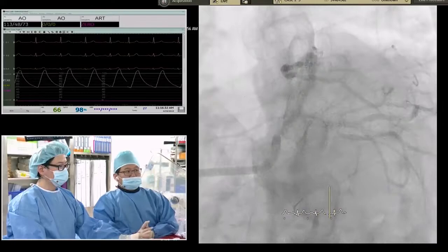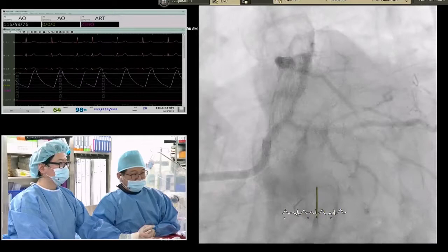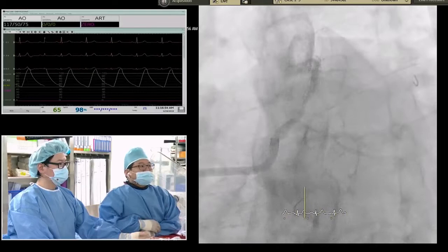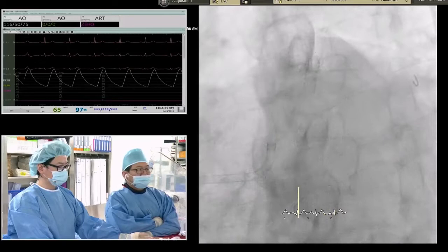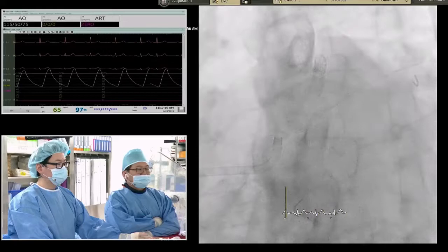However, look at this. It's very diffuse disease, even angiographically. Whether the FFR is positive or negative, we have to fix it from a technical point of view. We have to cross over from the proximal LAD to the main, and there is some diffuse disease in the circumflex. It should be compromised. So from this technical point of view, whatever the positive or negative FFR for the circumflex ostium, we didn't do the FFR for the circumflex, and just with a positive LAD, we're going to do the two-stent for that, right?